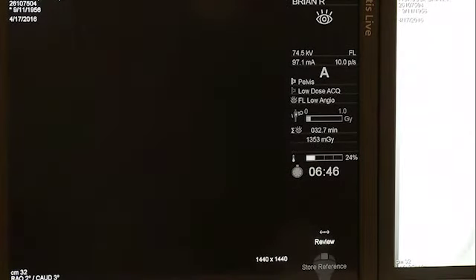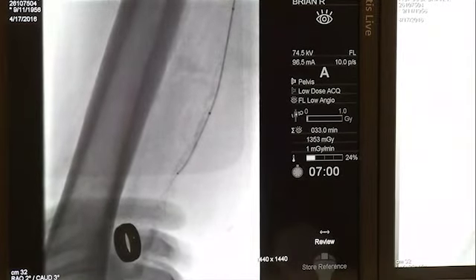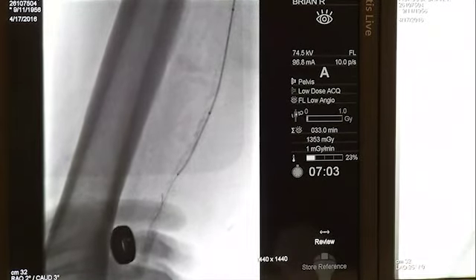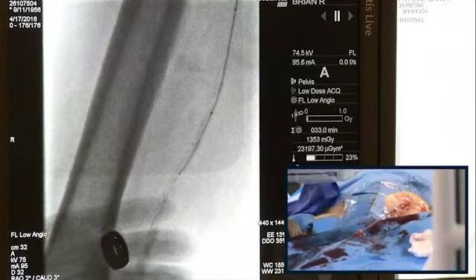Can you write that? Keep going. Okay, push it. Look, push it. Yeah, let me see. Come over here. Put some pressure here. Give me the torque, please. Mehdi, this is another stiff-angled glide wire. The other one was obviously destroyed. And I think in these cases, give him an ACT when you get a chance.